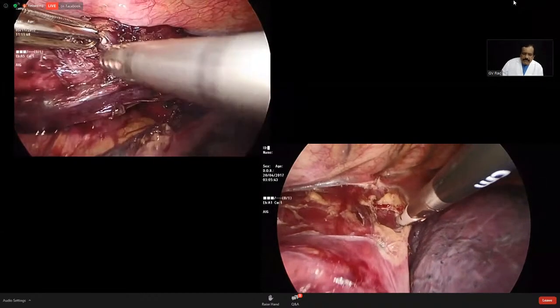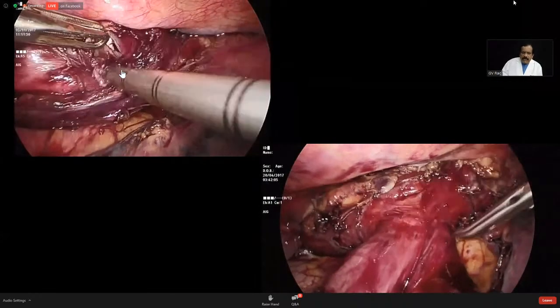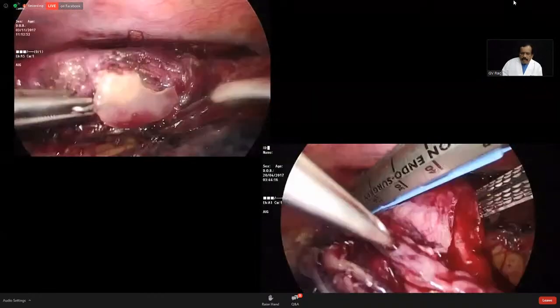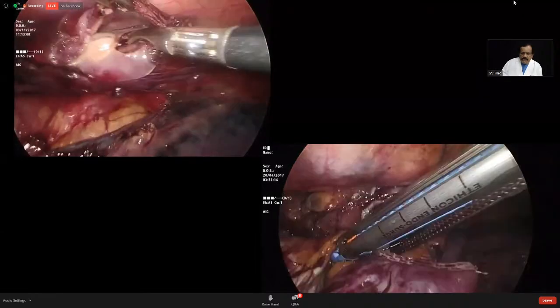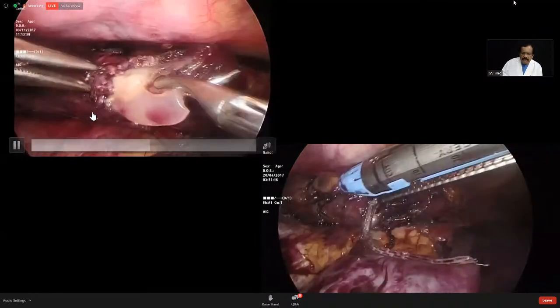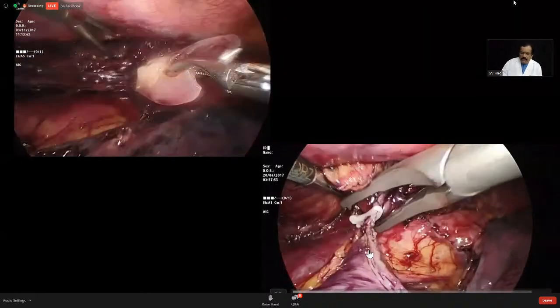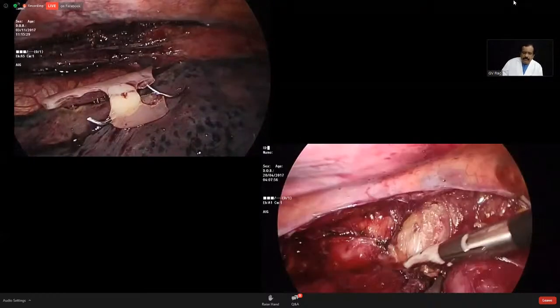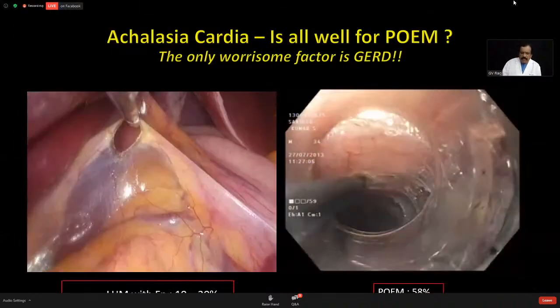In these circumstances, combined laparoscopic procedures are very, very useful, and this expertise makes these procedures much more amenable. More of these patients can be salvaged using these procedures, and you can see this. This is how we can extract this impacted denture, and likewise the diverticulum can be completely excised under endoscopic assistance.